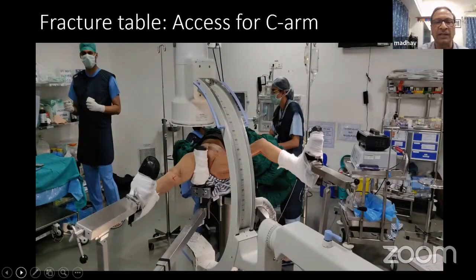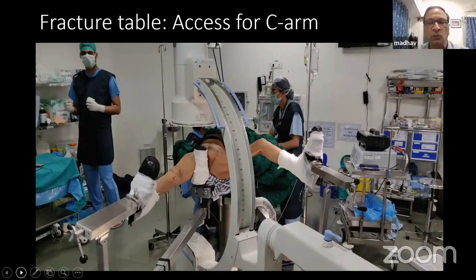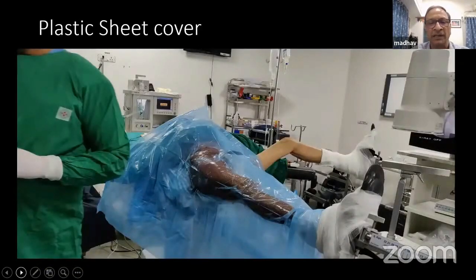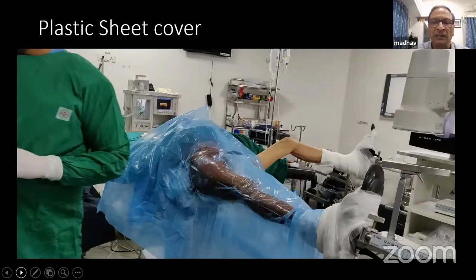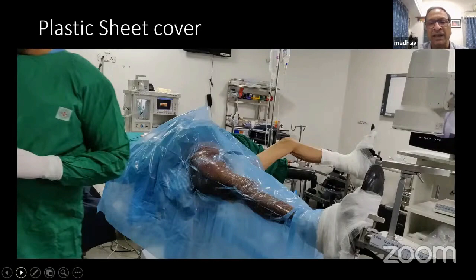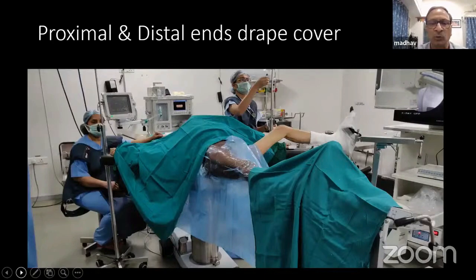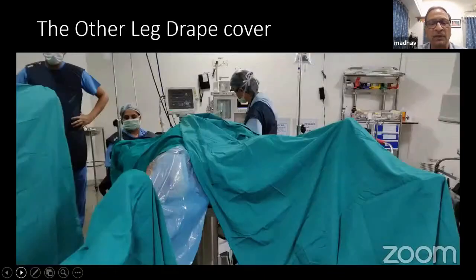That was a lateral view. One view is from in between the two lower limbs. The leg to be operated is the right one, which is straight. The other leg is flexed, abducted, and externally rotated at the hip, so as to allow good space for the C-arm to go in for the AP and lateral views.